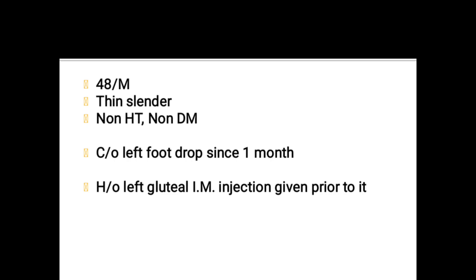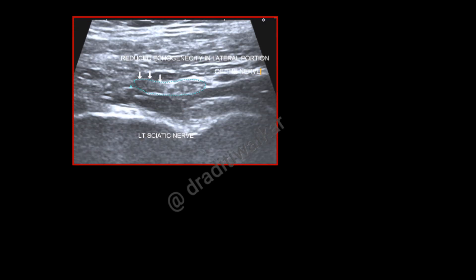His history was remarkable in that he had received a left gluteal intramuscular injection just prior to developing this foot drop. Considering the history, it is clear that there is some problem with the sciatic nerve, particularly the common peroneal nerve component. So I started scanning the sciatic nerve from the gluteal region.